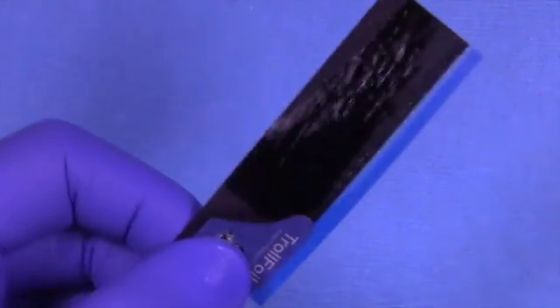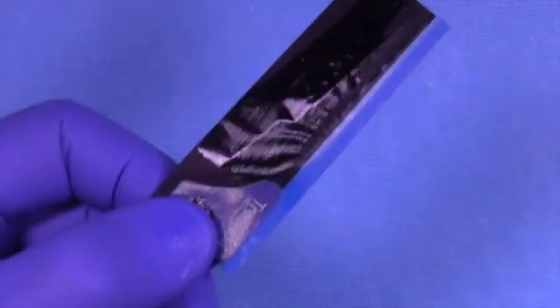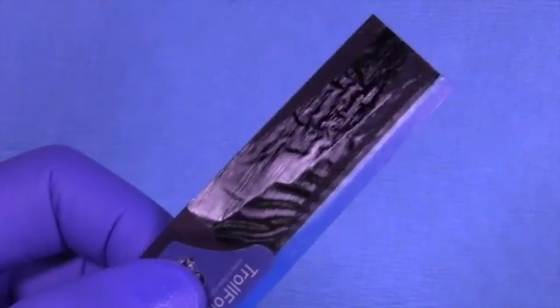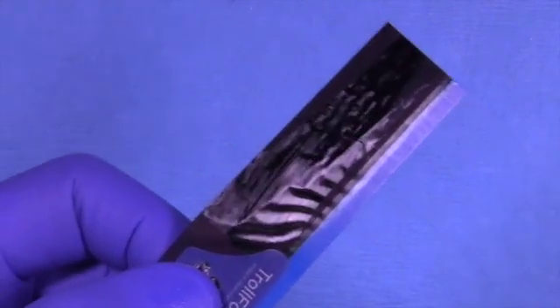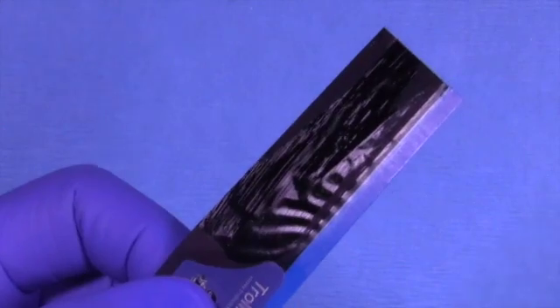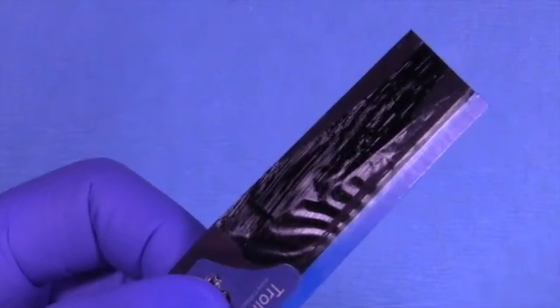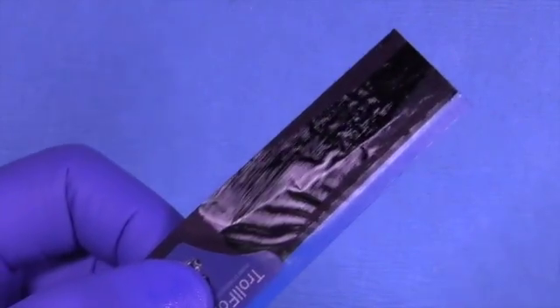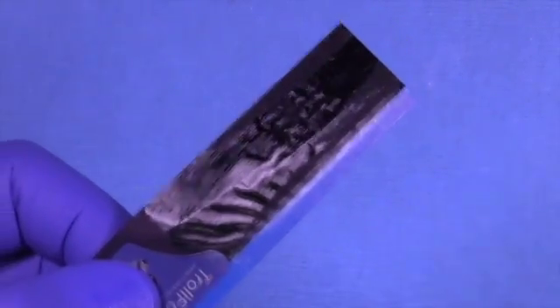This is a trick I have known for basically three decades. When you can't get the paper to mark, make sure the paper is fresh and hasn't run out of ink or gotten too dried out. Also throw a small film of vaseline on both sides of the paper, make sure the teeth are really dry, and when you have the patient bite down you will transfer the ink to the tooth very effectively. It's an incredibly useful technique.